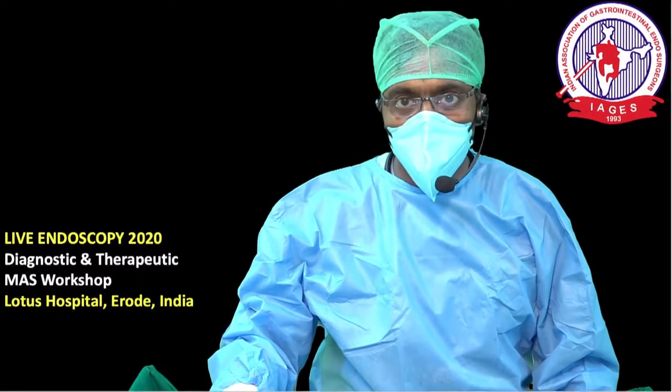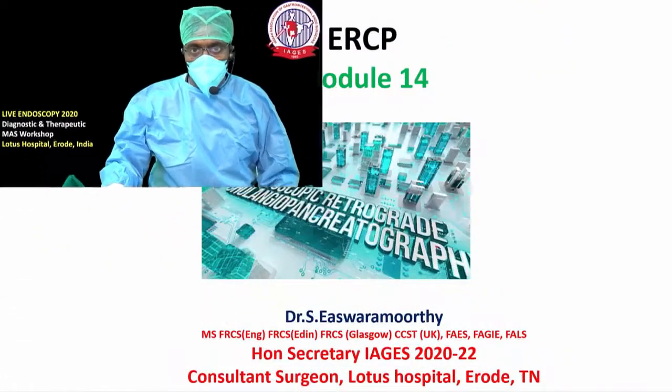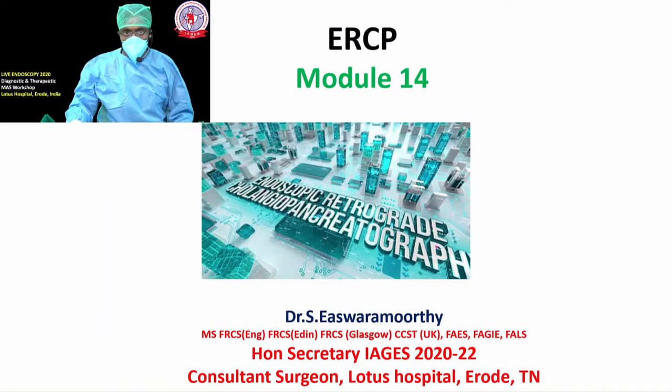Friends, for this module on ERCP, we are going to show you two cases of ERCP. Before that, as a basic endoscopy course trainee, we need to understand some background knowledge on ERCP, which I'll present in the next 5 to 6 minutes.